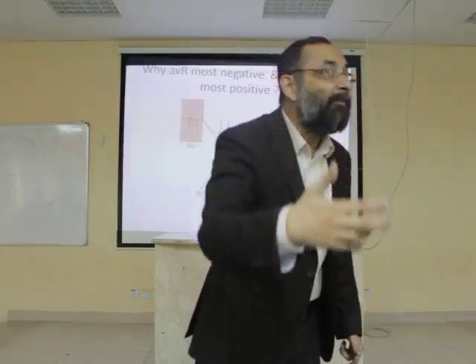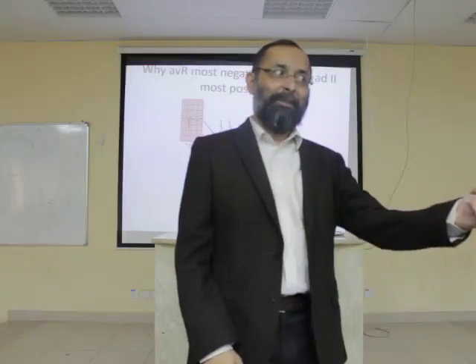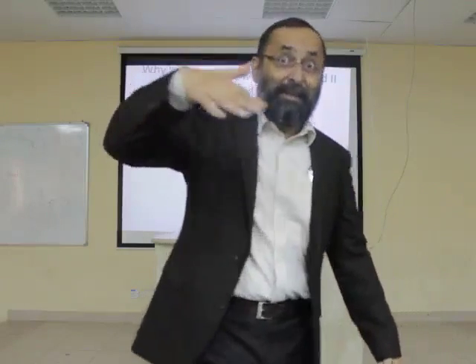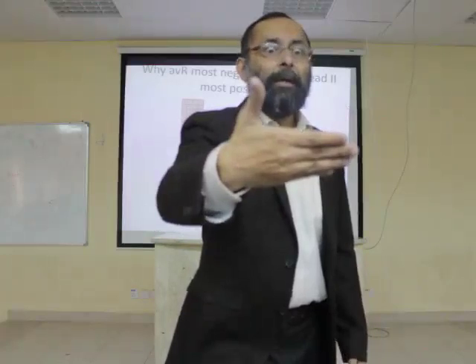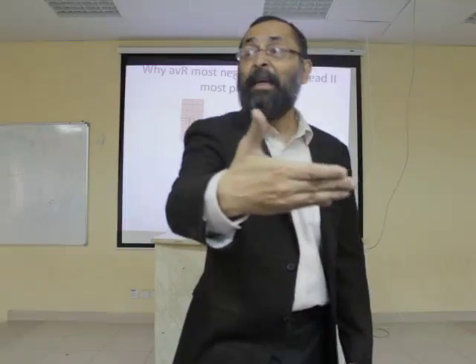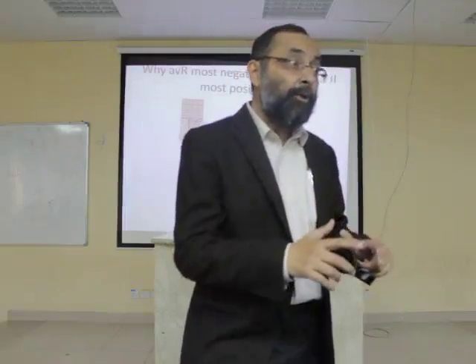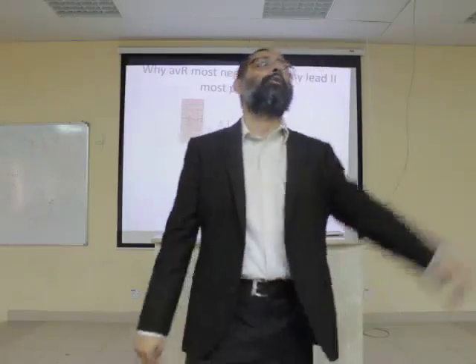What kind of wave morphology do you see in AVR? Negative. Why? Remember the rule? If your electric current is moving away, which lead will show negative waves really? AVR. And which lead will show you the best positive waves, approximately maximum positive waves? Lead 2 is the best lead.